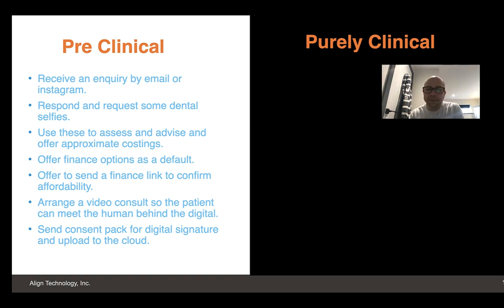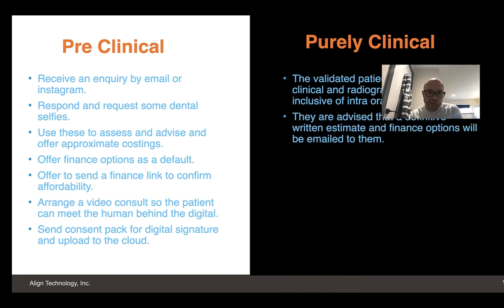But hey, so what's purely clinical? The validated patient by then attends for a clinical and radiographic examination, inclusive of intraoral scans, obviously. They are advised that a definitive written estimate and finance options will be emailed to them. You could do it there and then, but for those who feel the need to take a step back and assess, or if it's a complex case, you've got the scans. You could very easily, as we'll show you later in the webinar, have a virtual consult again.